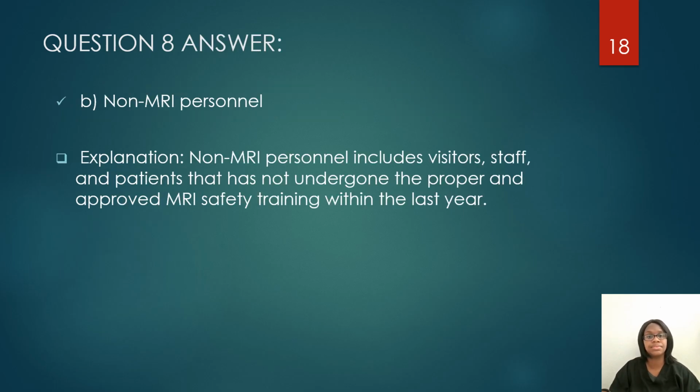Non-MRI personnel. These are the visitor, staff, and patient that has not undergone the proper and approved MRI safety training within the last year.